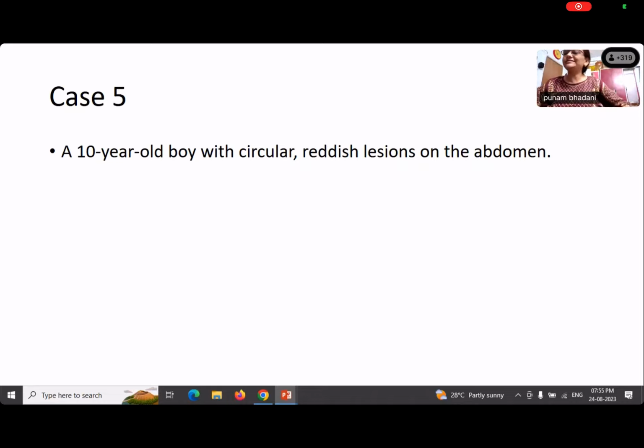Already explained all things nicely. So students should know what is cutaneous lupus erythematosus and what is generalized, whether it is systemic or cutaneous. So detailed clinical history is very important, and different types of cutaneous lupus erythematosus are already explained by Dr. Lakshmi and Dr. Udit. So okay, we can go ahead. There is importance of IF in these cases. Just by looking at histopathology, it's not possible to say whether this patient is going to have systemic lupus erythematosus or not. So the bottom line is you need to have the clinical information and other autoantibody profiles and things like that. I think that's the take-home message that all of you need to understand.